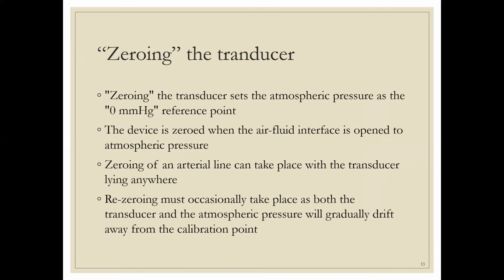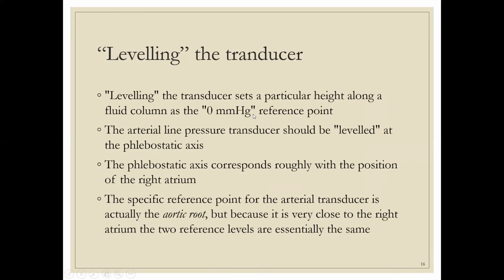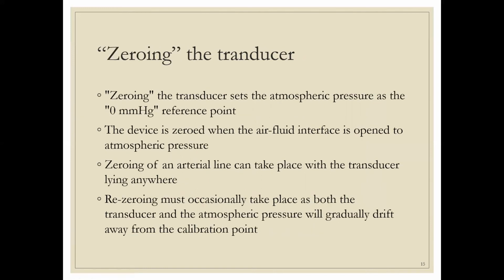If you are living at 100 meters above sea level, there will be some amount of atmospheric pressure, and whatever BP we calculate, that is over and above. So when a transducer is being manufactured, it doesn't know what the atmospheric pressure is. So once we set up the system, it is our work to make the transducer understand what atmospheric pressure is.